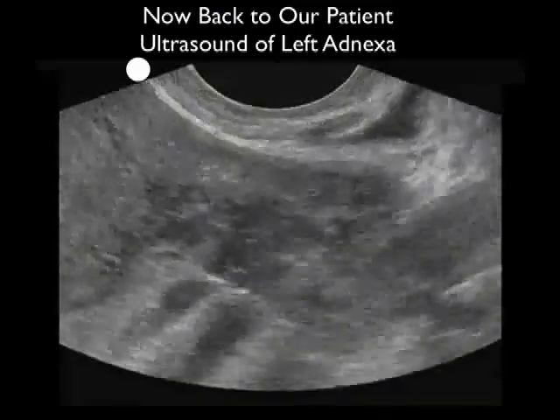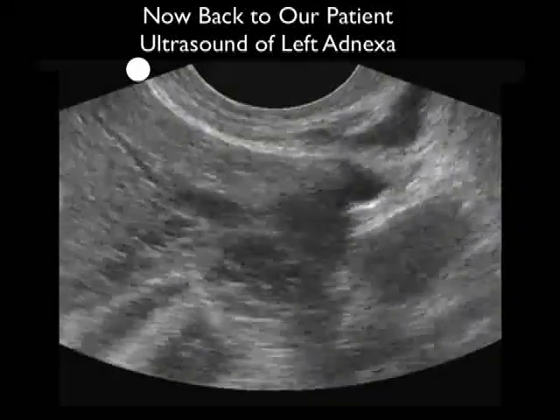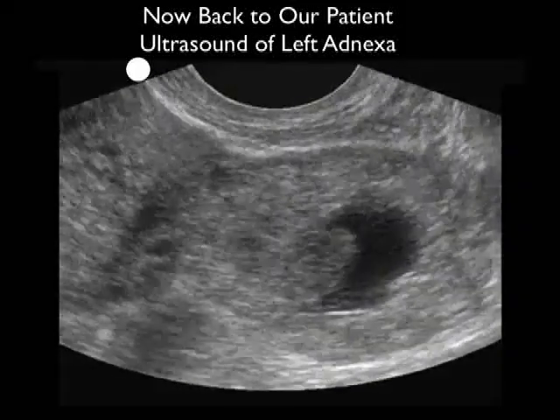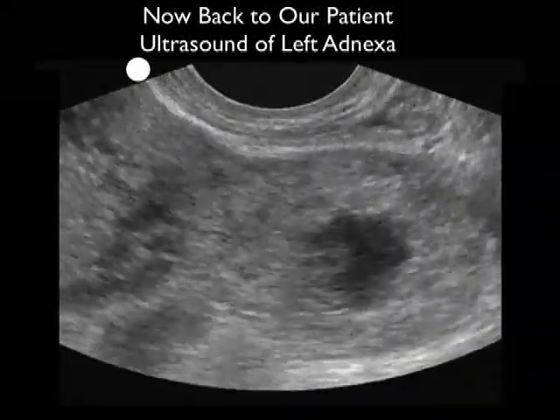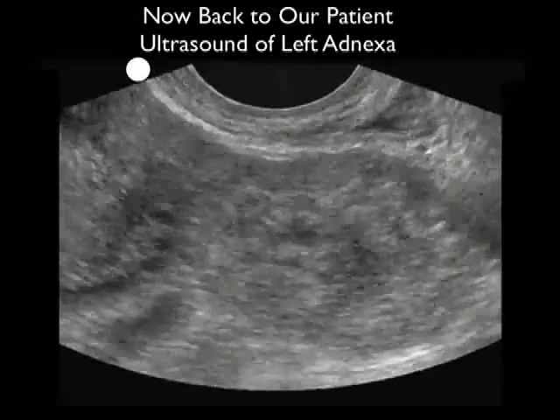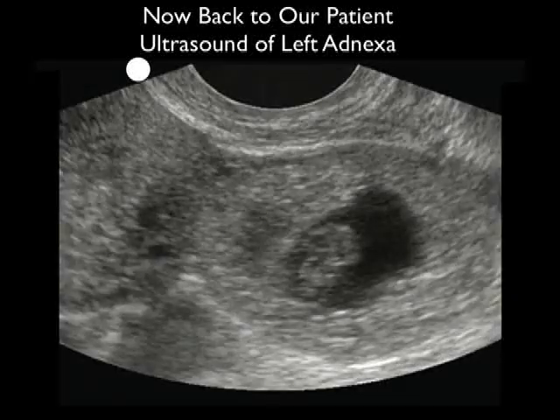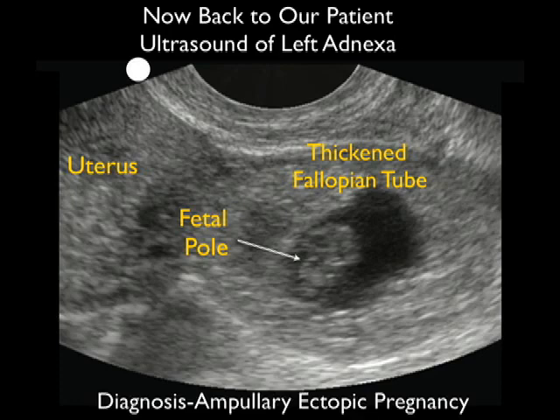So, returning to our case, given the presence of a positive pregnancy test and the absence of an IUP on bedside ultrasound, we were very concerned about ectopic pregnancy and decided to scan out to the left adnexa. Here, notice we're scanning out to the left adnexa and we have a positive finding. What we see here is a thickened fallopian tube comprising what is known as the bagel sign. And notice within the thickened fallopian tube, we have another positive finding. That is the presence of a fetal pole. So, in this patient, we were able to diagnose an ampullary ectopic pregnancy, and our next move was to call OB/GYN stat for a consultation.